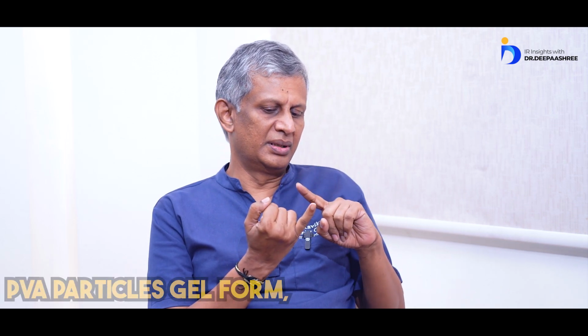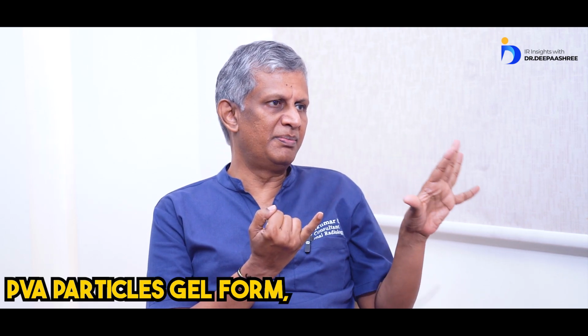So the key important take homes are that it should be a uniform distribution, be it PVA particle or gel foam, and pulsatile injection. You should follow it up with saline, every 1 ml followed by 2 ml of saline. Correct. So embolization becomes much better.